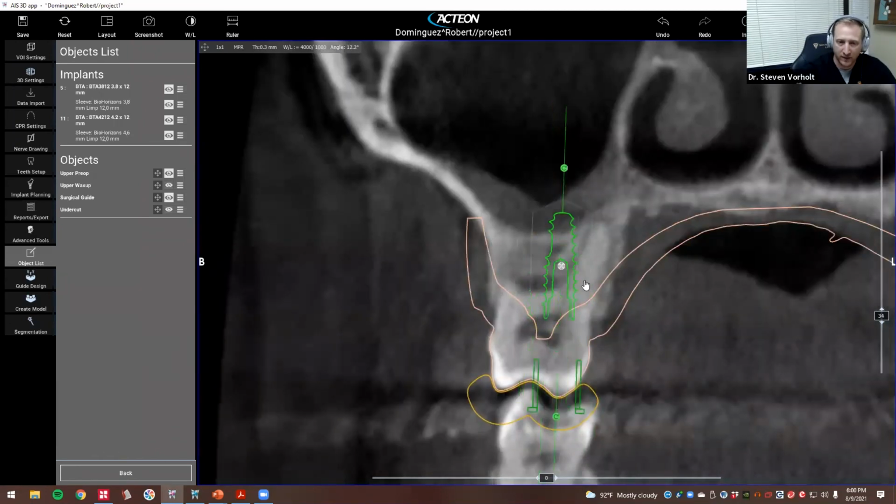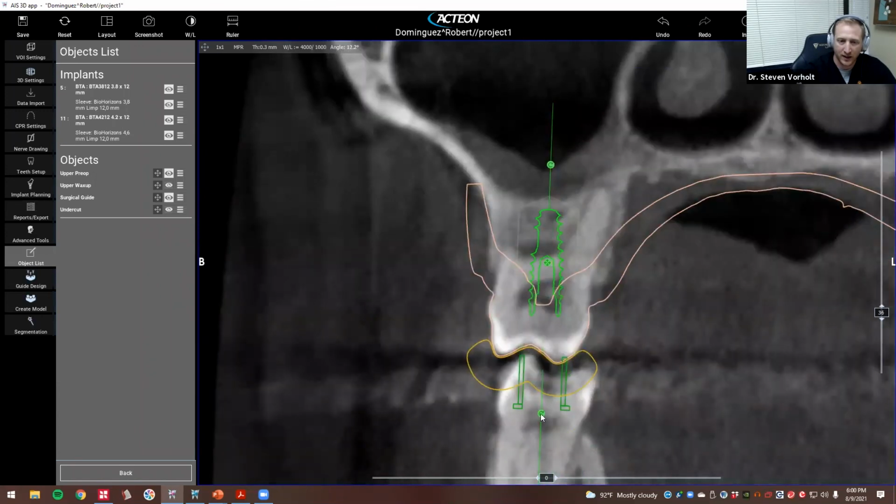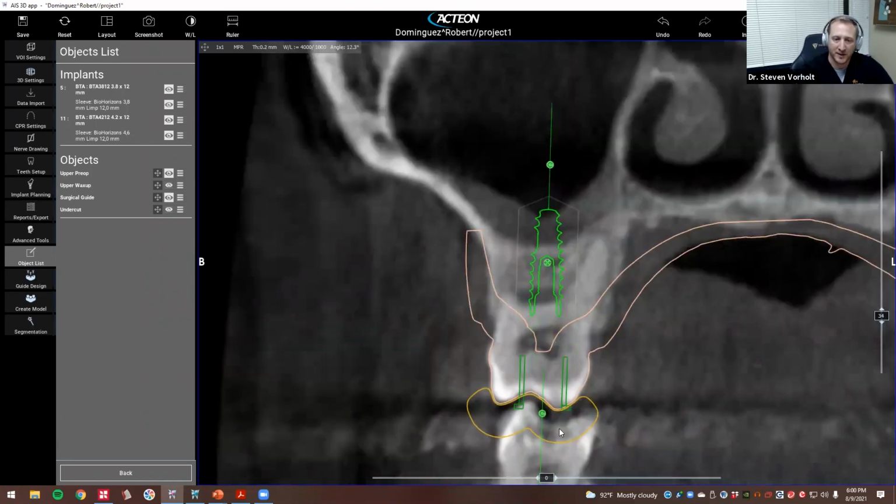And so with the first guide, the sleeve is down here. The guide says I'm doing my drilling, and I'm only drilling probably the 2.25, then switching to osteotomes or whatever Versa, whatever your direct technique is. And then once that's all done, I have my bone graft, it looks beautiful. I'll slap on my placement guide and place my implant through the placement guide. Alternatively, you could just not have a placement guide and place it freehand. There's any sort of combination of those too.